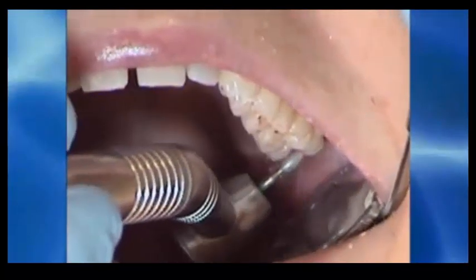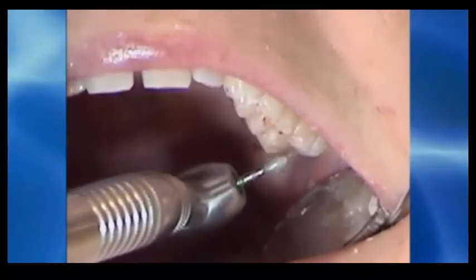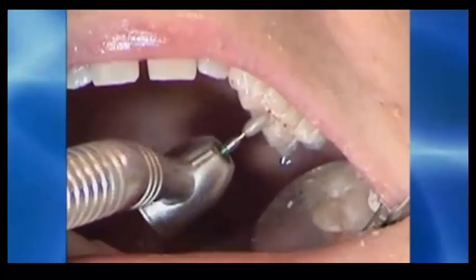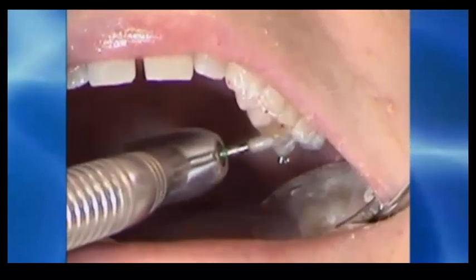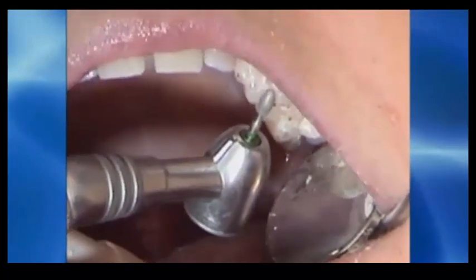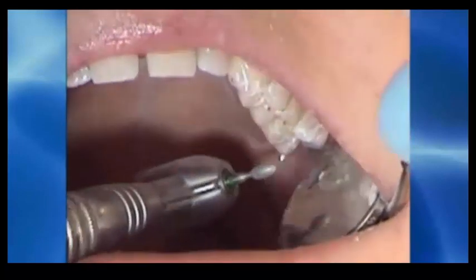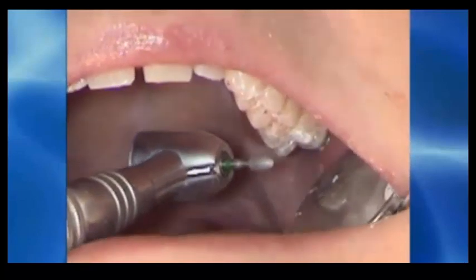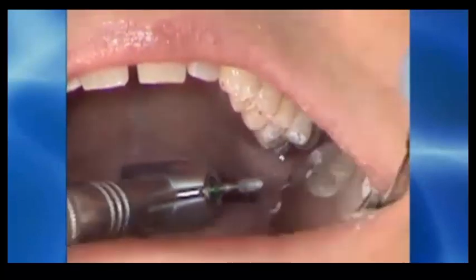After remarking the teeth in the same fashion as before, with the patient sliding in both directions from their MIP, I'm now trying to remove the last little bits of friction, any kind of drag that we see on the teeth, any linear contacts. And notice that I'm just sort of lightly touching the teeth with the burr, cleaning up around the contacts that I wish to keep. You can see two of them in the central fossa of the first premolar and second premolar.